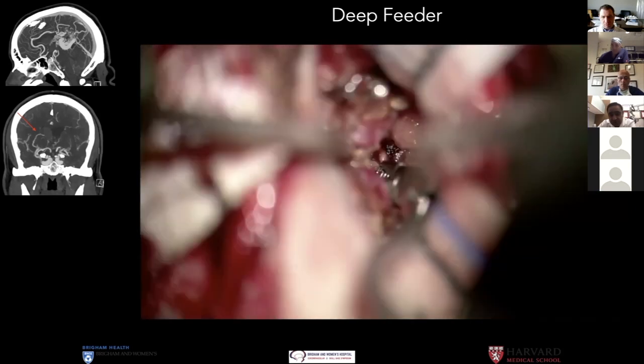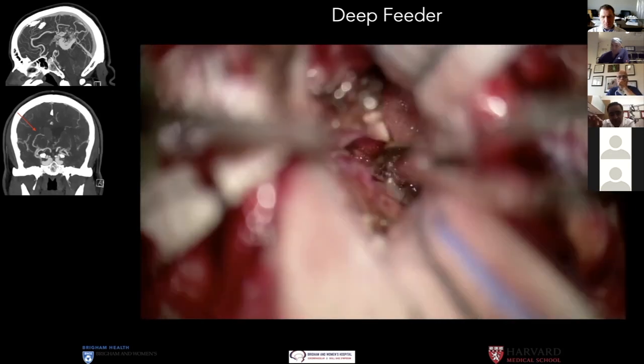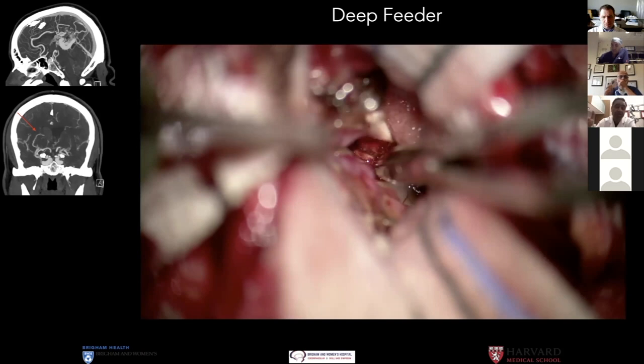I'm going to clip it to take the turgor out of the wall. Remember, these are not normal arteries. They're distended due to the physiology. It's not a neoplasm, but so much blood is flowing through that the vessel wall has expanded and thinned. So if you just try to bipolar it, there's not as much protein in the wall and it might pop. So Dr. Sundt made these clips to decrease the turgor in the vessel, so then it can be bipolared safely and cut. So you're not chasing it.